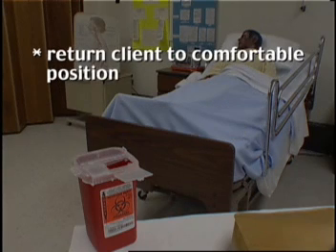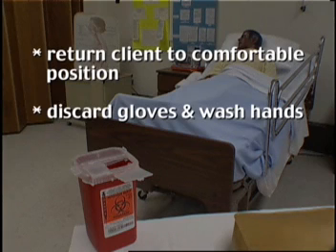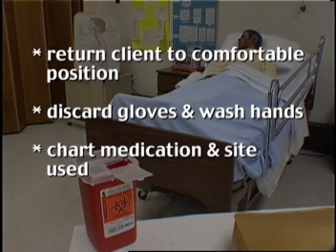Return client to comfortable position. Discard gloves and wash hands. Chart medication and site used.